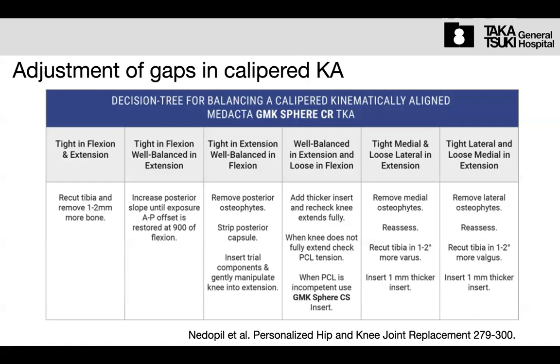Yes, the tibial cut, because once we cut the tibia, both extension and flexion gaps are enlarged.